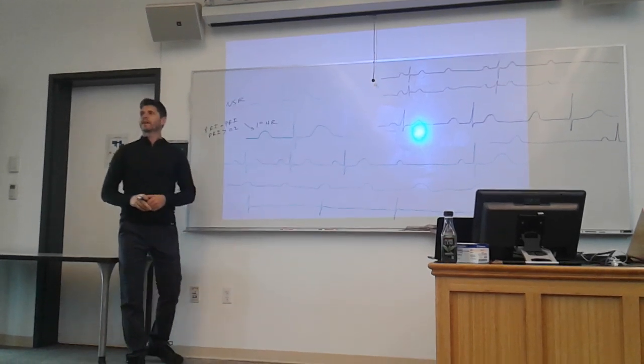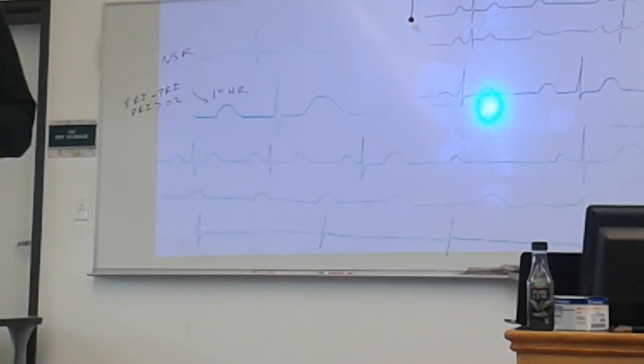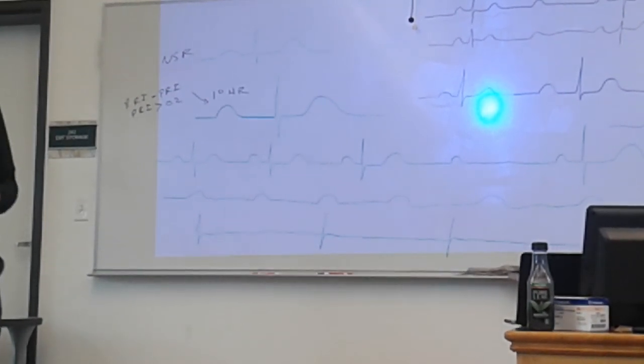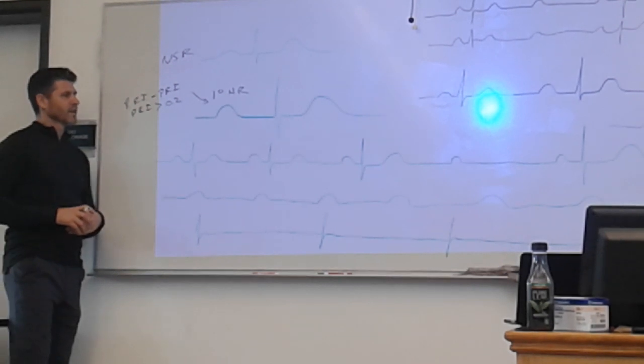And a first degree heart block is constant in each beat. Meaning if I say that, then how are you going to define the rhythm? Sinus. Normal sinus. With? With a first degree heart block. Good. I have a sinus rhythm with a first degree heart block, right?